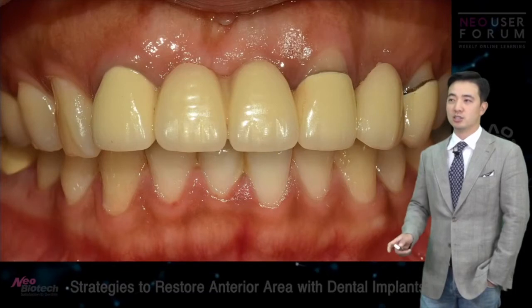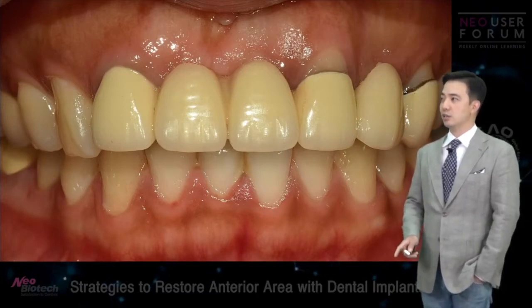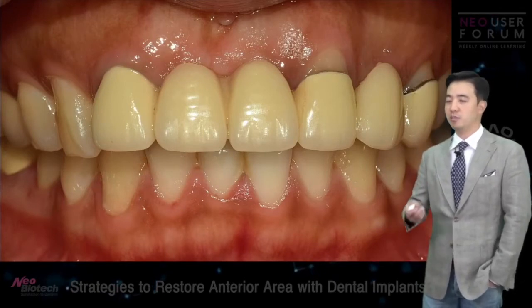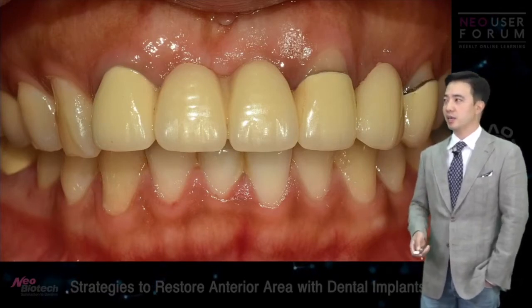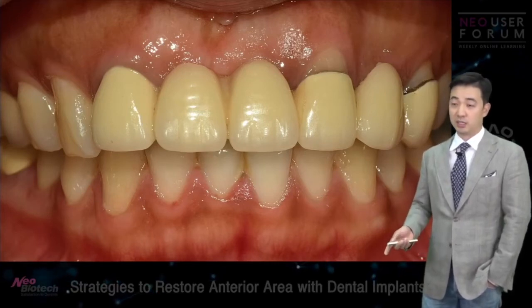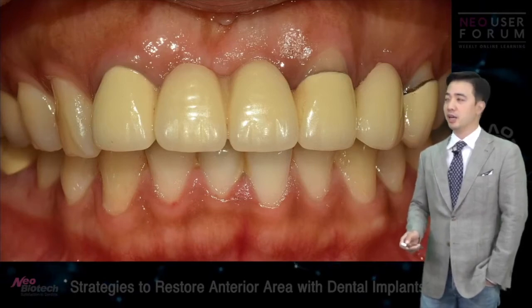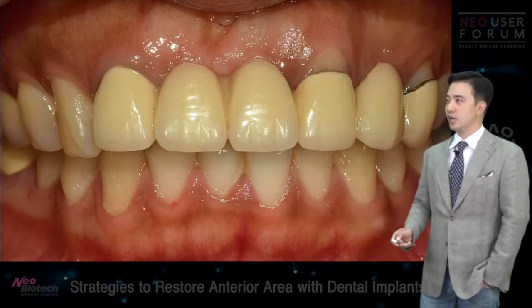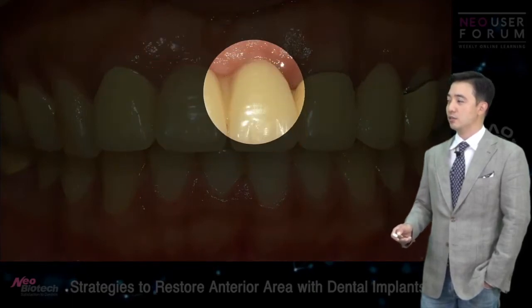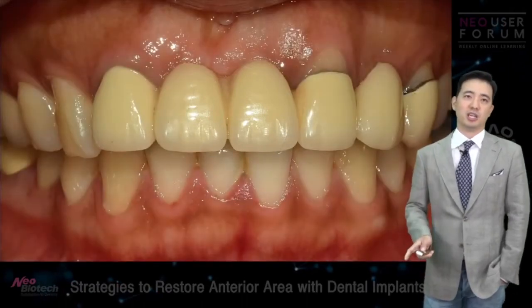But she had such a big trauma after that. Ever since her childhood, all she wanted was, I want my teeth back. By saying a tooth back, she meant that she wanted an implant on every single tooth. So I was thinking, okay, 2 implants right adjacent to each other is going to be a challenge.